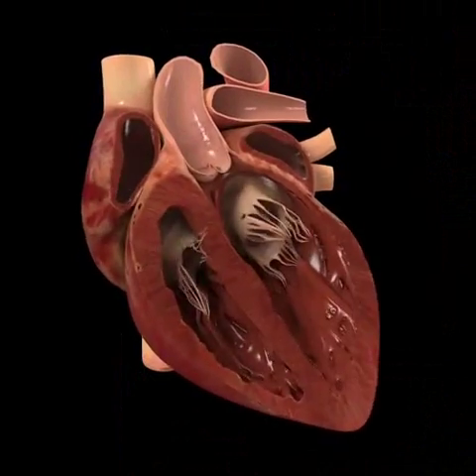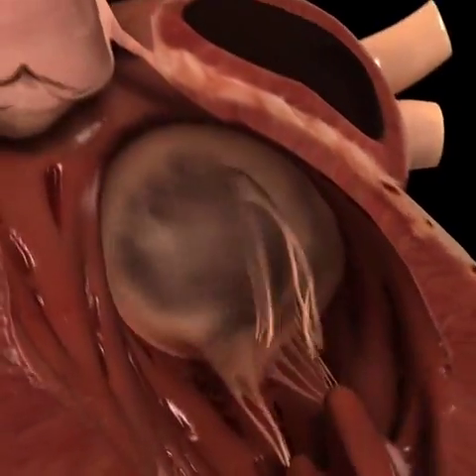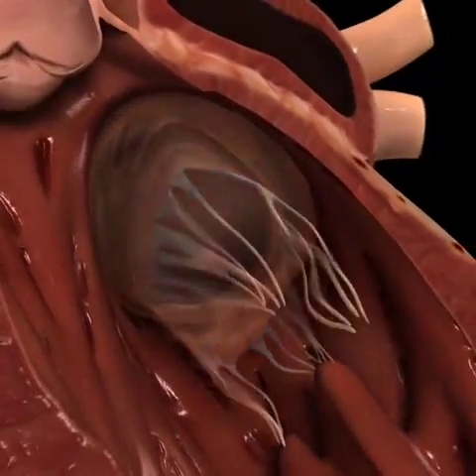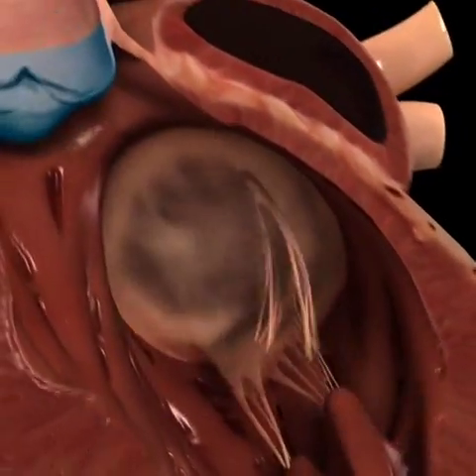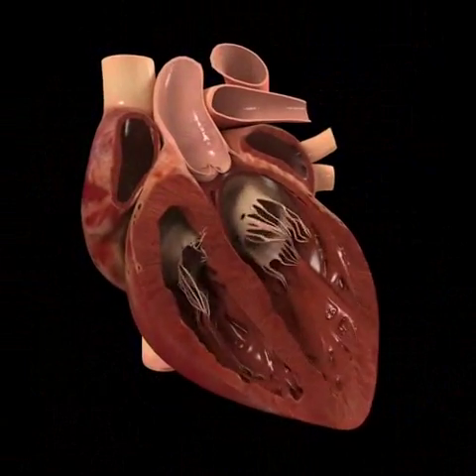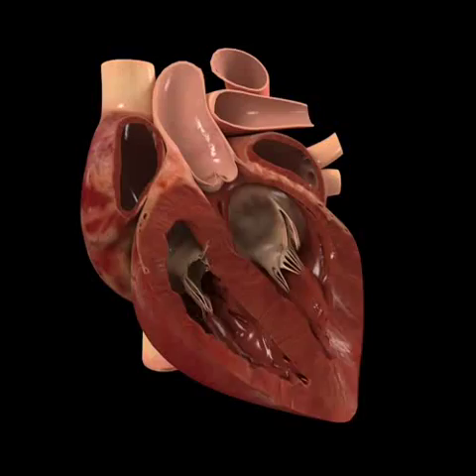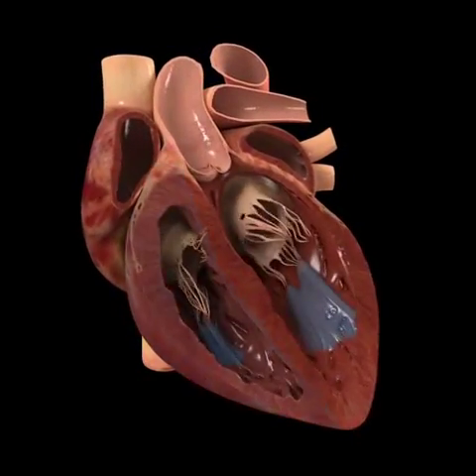We can see the anterior and posterior leaflet of the mitral valve. Inserted on them, we can see the tendinous cords. We can easily notice 3 of the sigmoid leaflets from the aortic valve. We can also see the interventricular septum on its basal and apical dimension. The left and right ventricles and the posterior papillary muscles can also be seen.